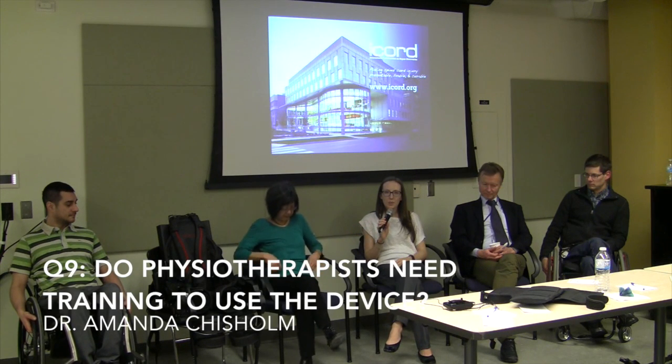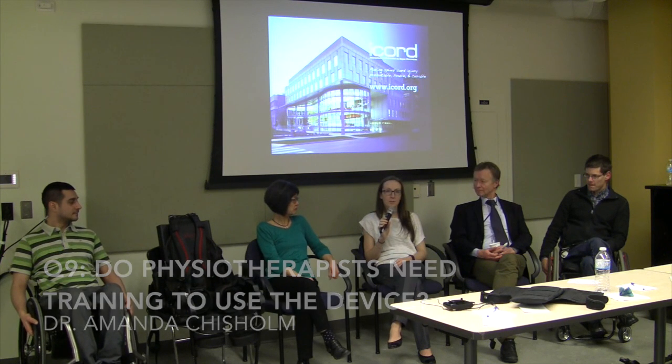I think EXO is a lot more extensive. For the EXO training, we did 4 full days of training with their physiotherapists that come up from the company. Then we practiced with the device for the next 6 months, and they came back for phase 2 of training, and we did 3 more full days with them. In between that time, they also came back a third time because they updated their software and added a new feature, so we were updated on their new technologies.